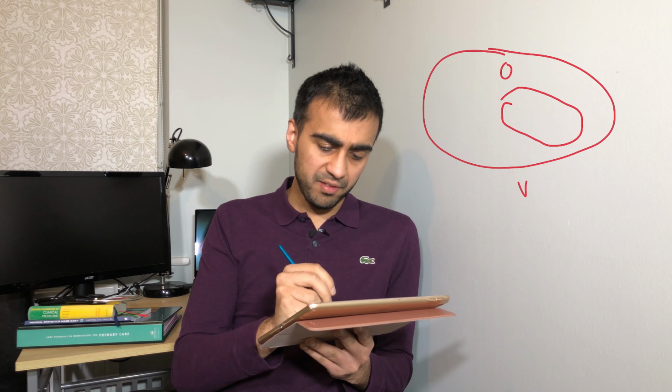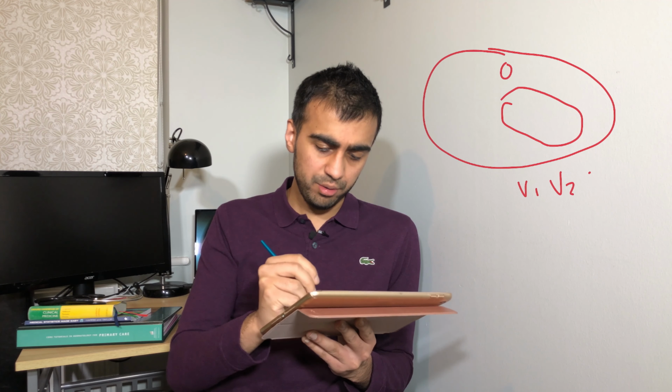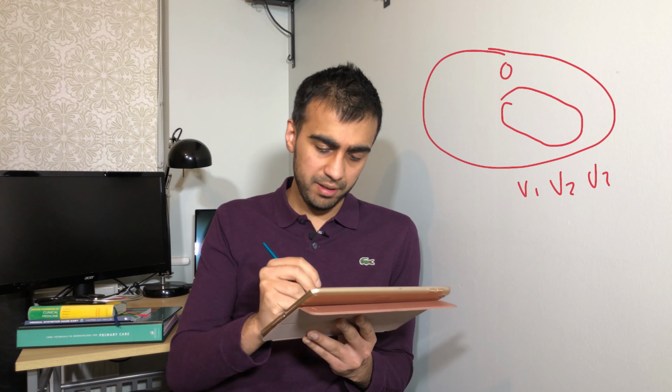Now you'll have V1 about here, then V2, then V3, and we're going to run out of space, 4, then 5 and 6, like that. Okay, so what each area does is it points at an element of the heart.